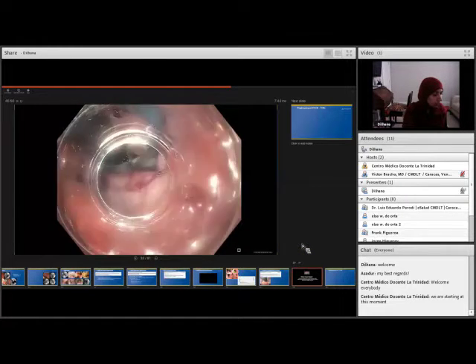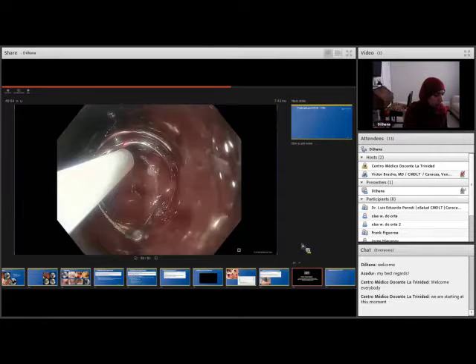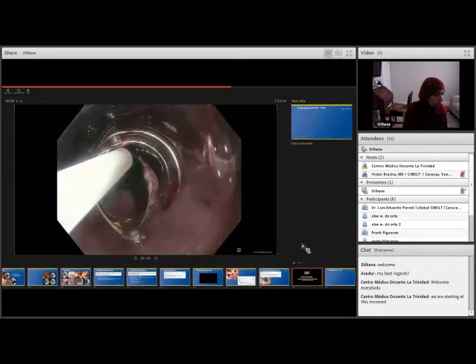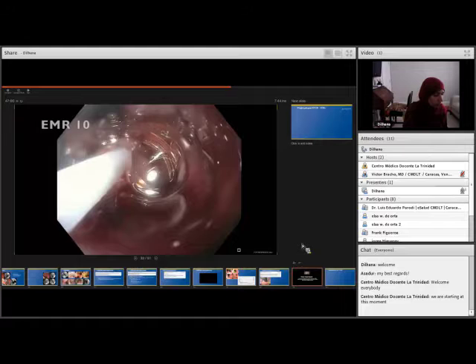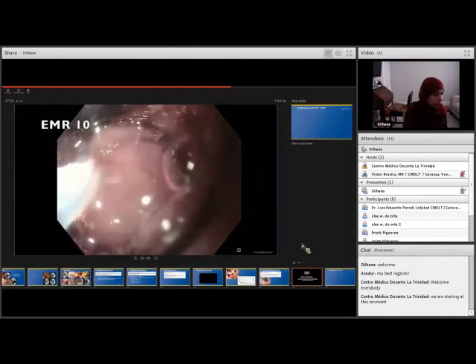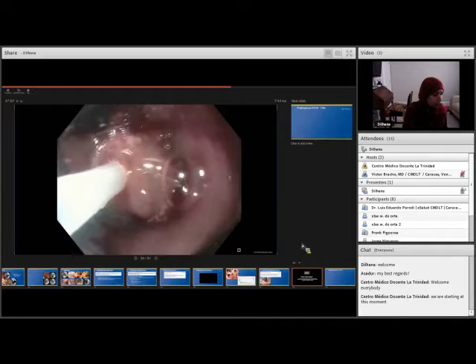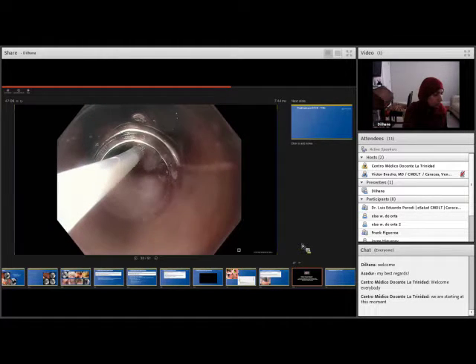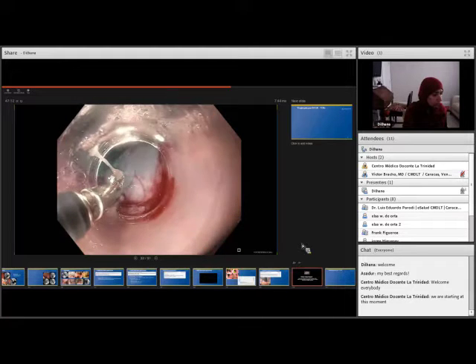The ninth resection was performed in similar fashion. The tissue was then re-examined in the retroflex view, and finally, the location of the last resection is found. Notably, in this scenario, given the difficulty of maneuvering the scope into position, the snare has already been opened and fitted around the cap. Thus, once the mucosa is suctioned into the cap, the snare is already in position to be closed around the mucosa, as seen here.